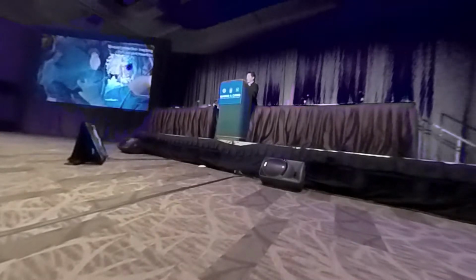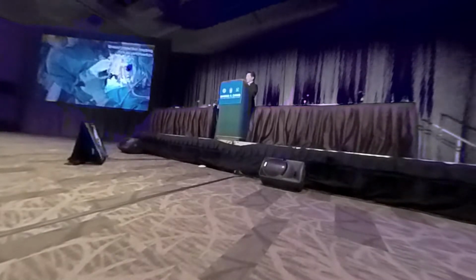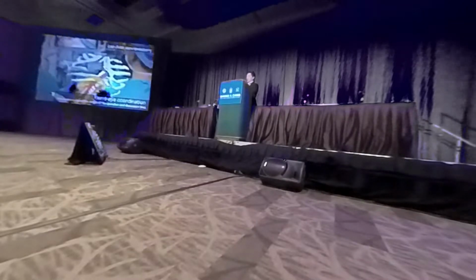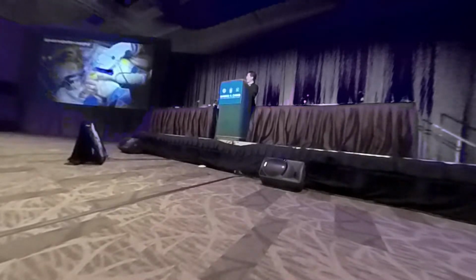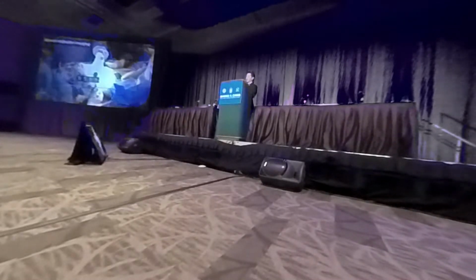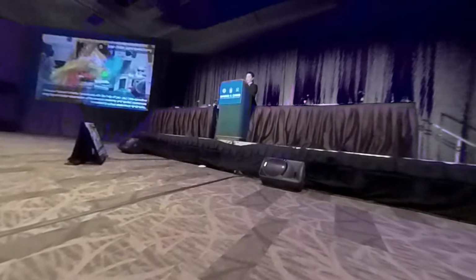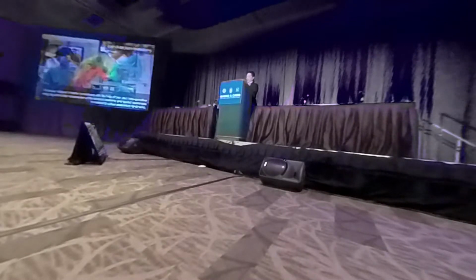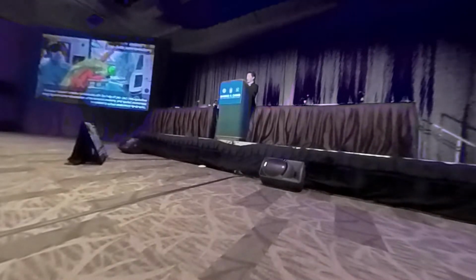We can put this data onto the patient's body surface, with spatial recognition mapping for laparoscopic port insertion. We can select the area of the surgical portion of the port insertion. So hand-eye coordination can be applied by using this system. And it is also available for spatial mapping and projection mapping onto the actual location of the open surgery. And this is a distal pancreatectomy. This could support complex procedures with the help of pre- and intraoperative imaging, with better visualization of the surgical anatomy and spatial awareness in relation to actual anatomical landmarks.